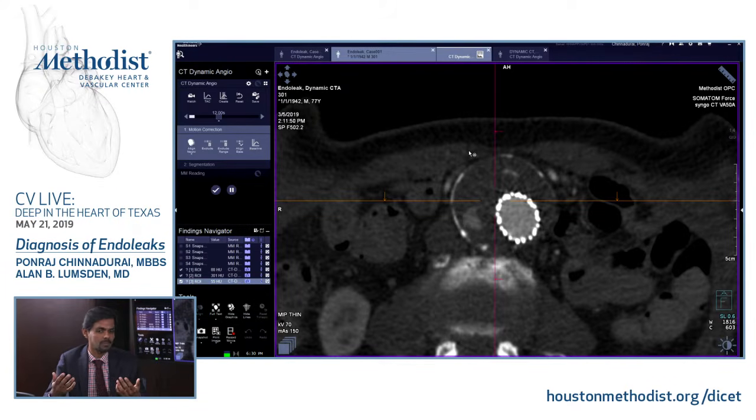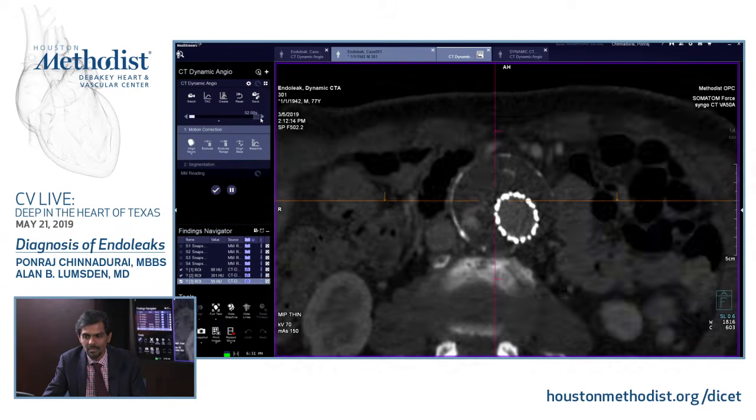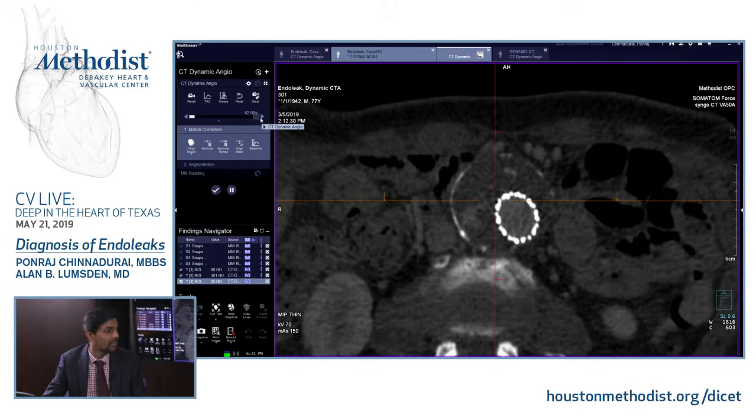If the patient has poor cardiac function or a low ejection fraction, then we have to time it to that patient. We haven't come through that challenge yet, but for example, here we have only imaged until 52 seconds. That's already quite a lot. By no means have we come to a set protocol. This is a learning process. As we learn, we evolve, we reduce our radiation, and we identify the sweet spot that we could image.